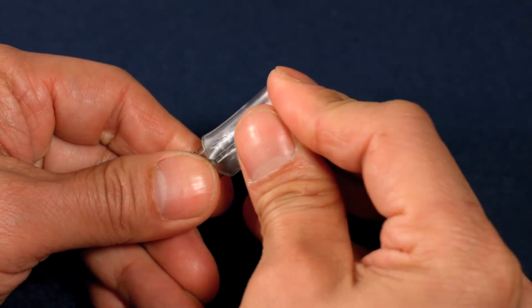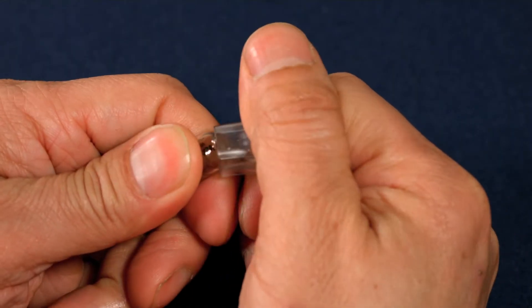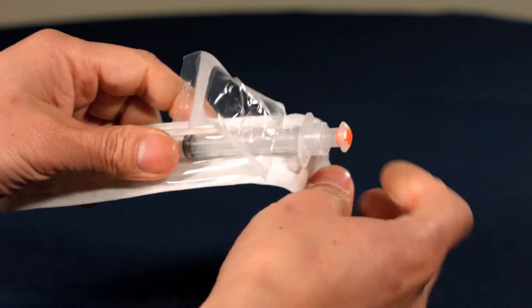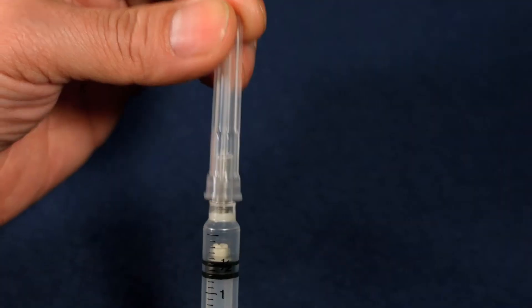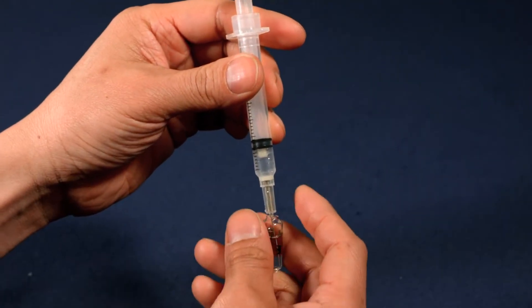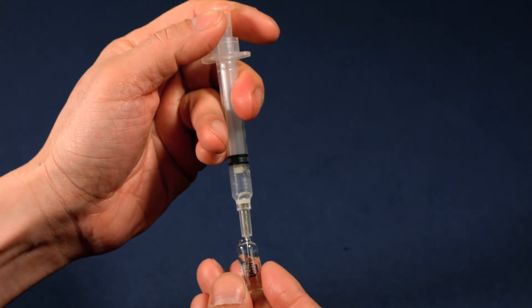There's less risk of breakage if you use an amp snapper as shown. Peel open the safety syringe and carefully remove the shield. Hold the ampoule with your non-dominant hand and draw up all the liquid from the ampoule with your other hand.